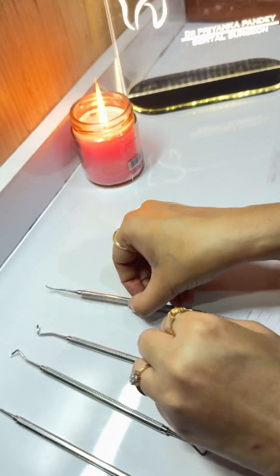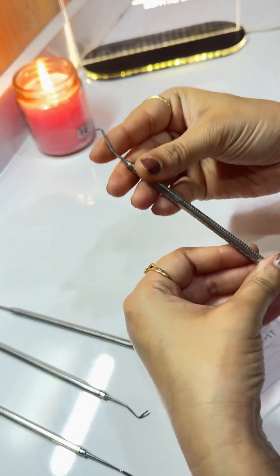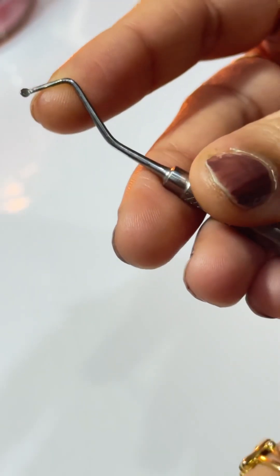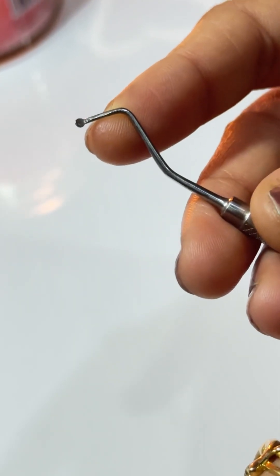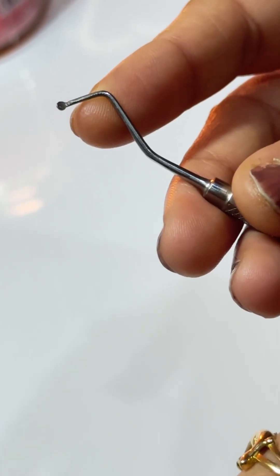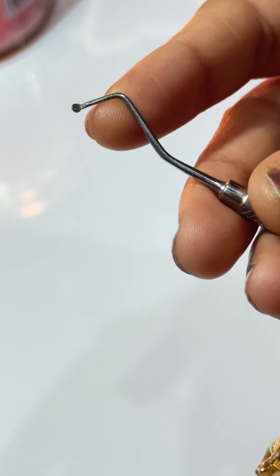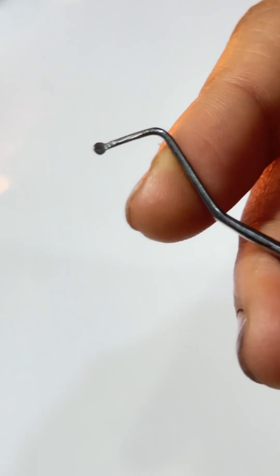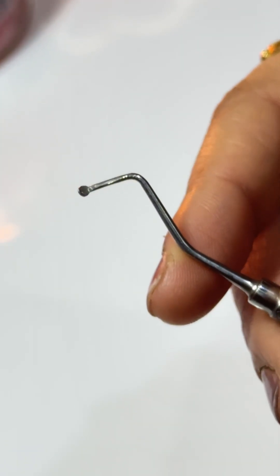Now we come to the last instrument, the spoon excavator. Its function is it is used for spooning or scooping of softened carious material. It is also used in carving amalgam or direct wax patterns.